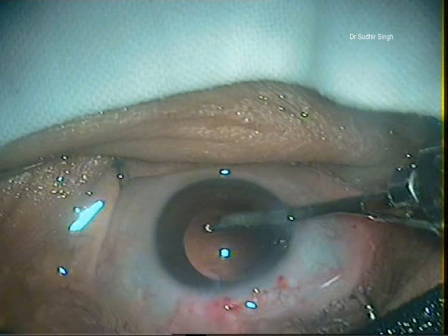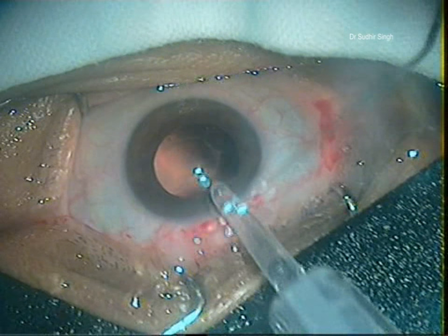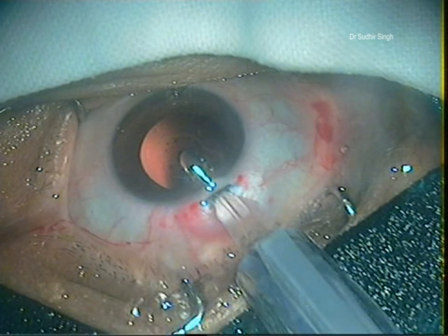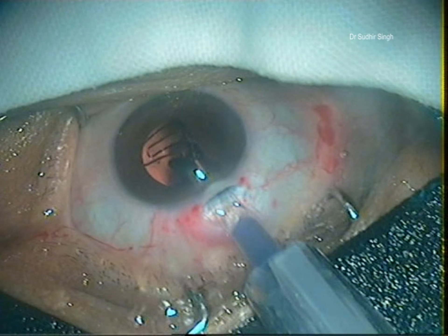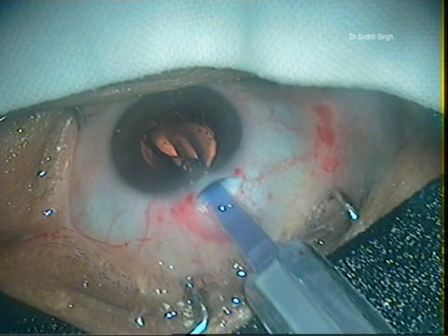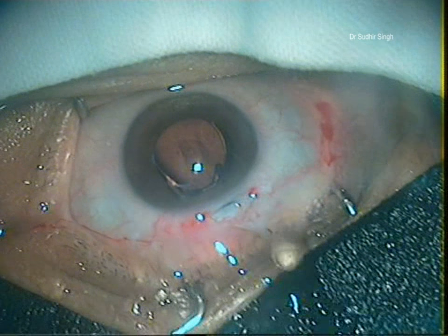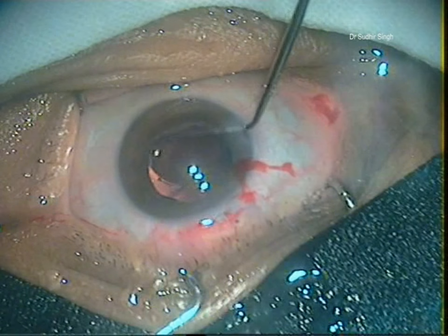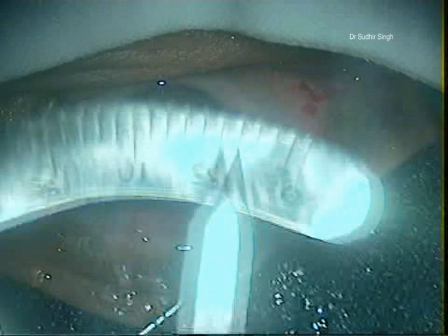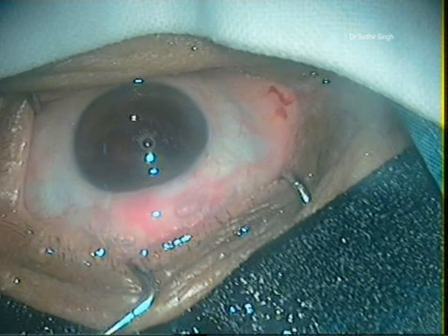Aspiration should be done from the side port only, as the anterior chamber remains deep. The anterior chamber is formed with viscoelastics. A single-piece foldable intraocular lens is implanted into the capsular bag. Remaining viscoelastic is washed out. The port is sealed by hydration and the conjunctival flap is reposited.